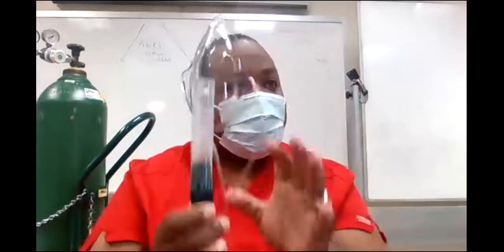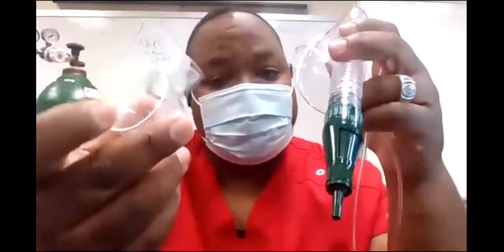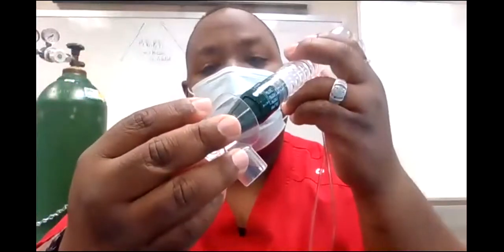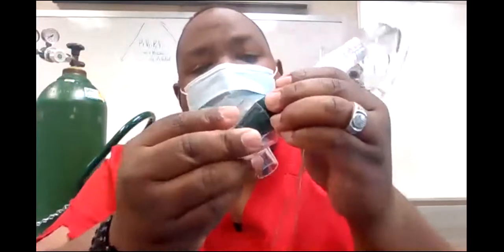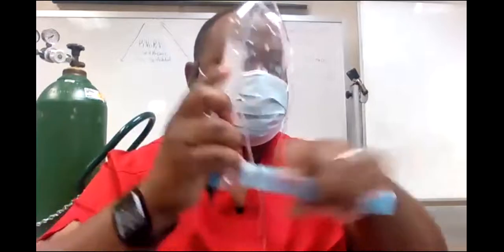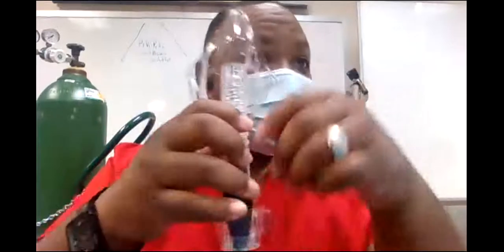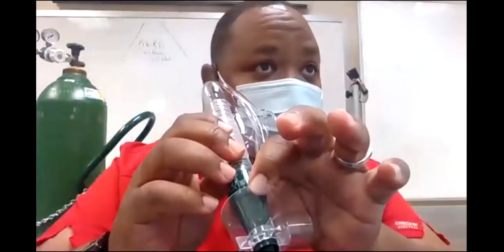So this is a pre-made Venturi mask. Comes like this. It's kind of cute. But we also have some that we make ourselves as respiratory therapists. Now, one other aspect of the Venturi mask, look at this little cup here. This cup comes off, but this cup fits on there like that. It serves 2 purposes. For one thing, if the patient is breathing, I can give him a breathing treatment through here, okay? I can give him a breathing treatment through here with the little nebulizer right here and give him his breathing treatment at the same time. The main reason is to protect these windows, okay?